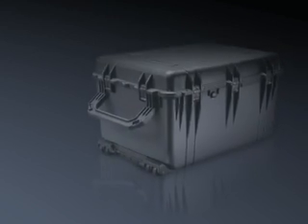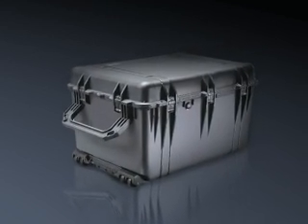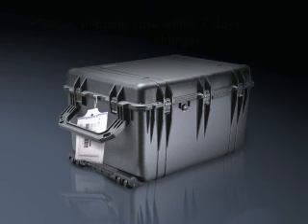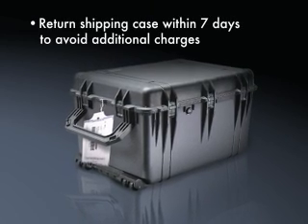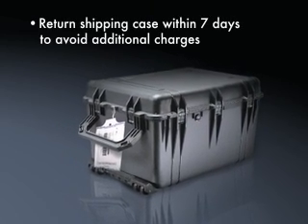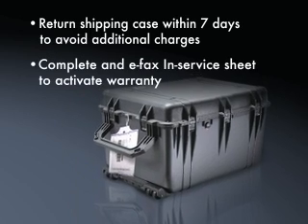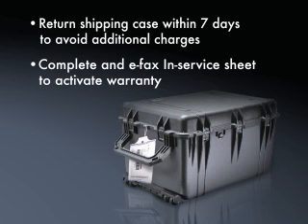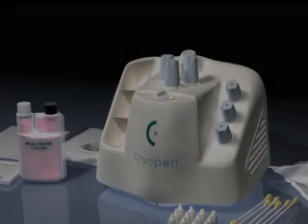The shipping case must be returned. Place all foam pieces back into the shipping case. Using the tie wrap, attach the supplied shipping label to the side of the case. Call FedEx to schedule the pickup. Failure to return the shipping case within seven days of delivery will result in additional charges. Complete the in-service sheet and e-fax to CryoPen. Completing the in-service sheet will activate your warranty and will ensure that you receive future system information.